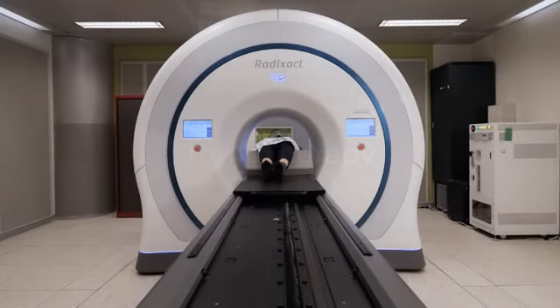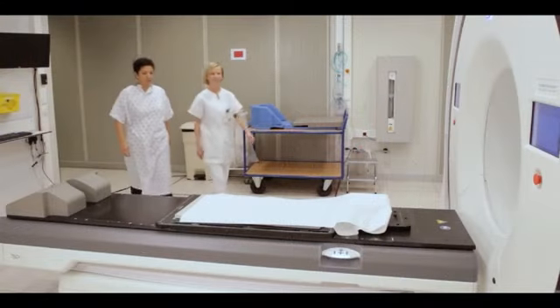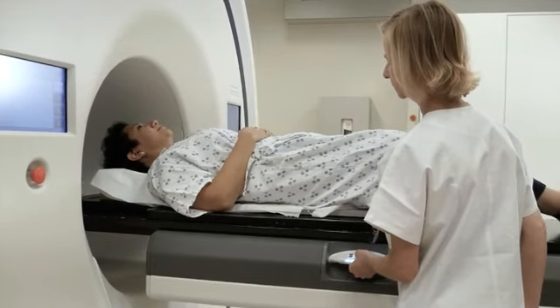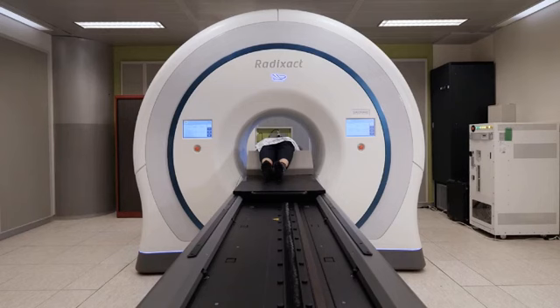So now I'll talk about the tomotherapy system, which is a trade name of a system made by Accuray Incorporated. As you see, it looks a lot like a CT scanner, although on the inside it's different, as I'll explain. But basically the patient gets on the couch and there's a continuous motion of the patient through the bore as the treatment progresses, so that you can treat a field up to 135 centimeters long.